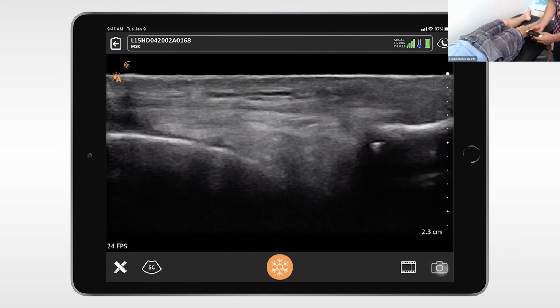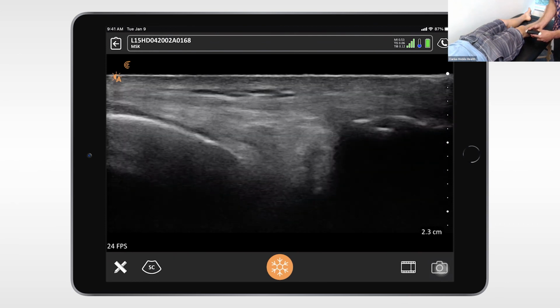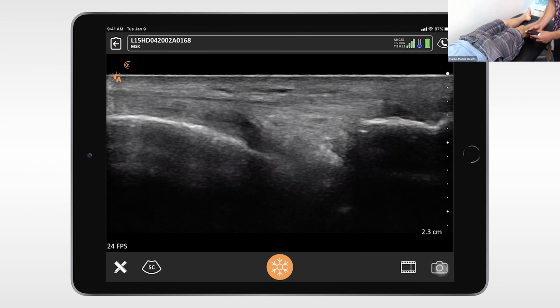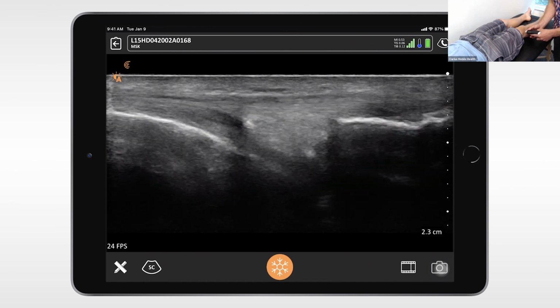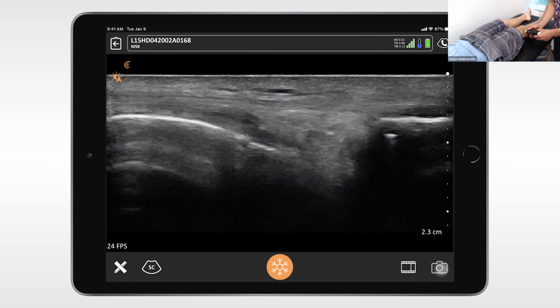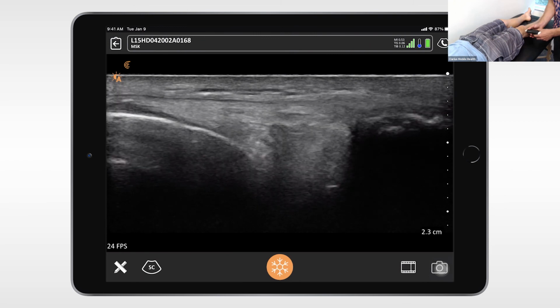Yeah, and then the lateral, we kind of see the same thing on the lateral, right? So kind of take a look here. Yeah, so the lateral side is a little bit more difficult from a meniscus point of view, but laterally you can really see the collateral ligament quite well, and some fluid collections around the ligament.